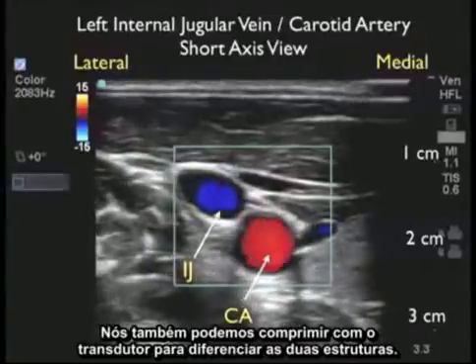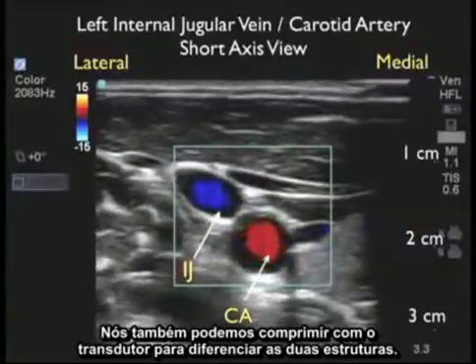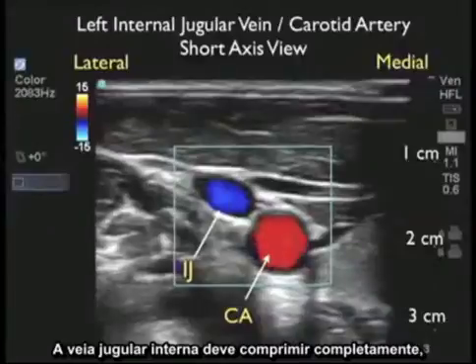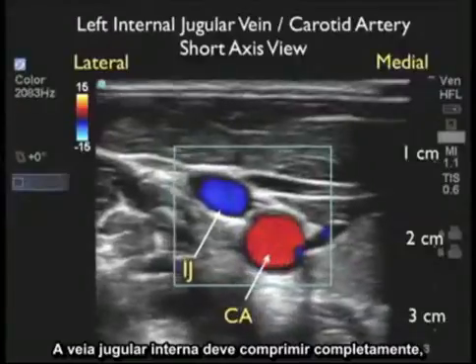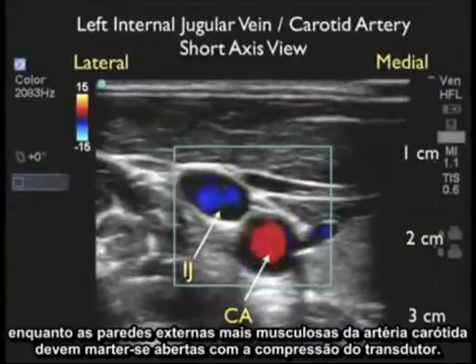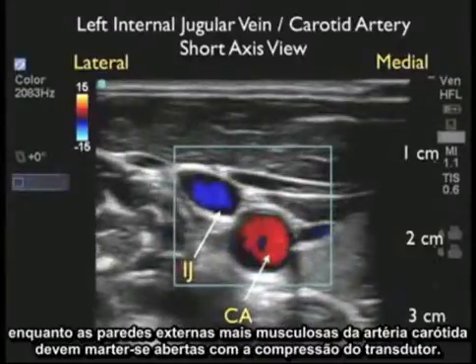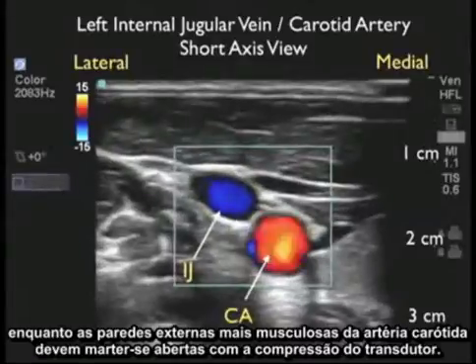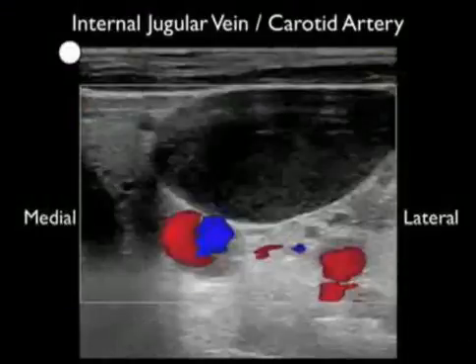We can also press down with the probe to differentiate the two structures. The internal jugular vein should compress completely, while the more muscular outer walls of the carotid artery should keep it open with compression of the probe.